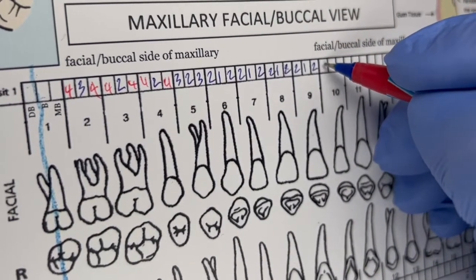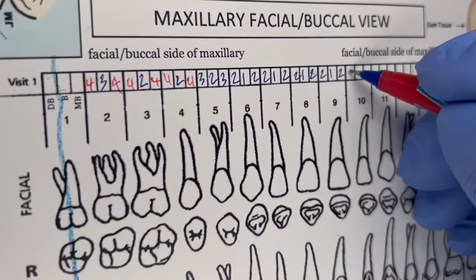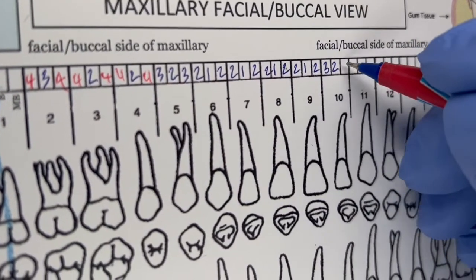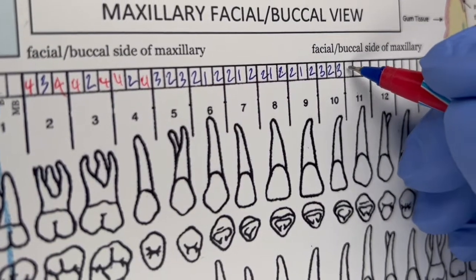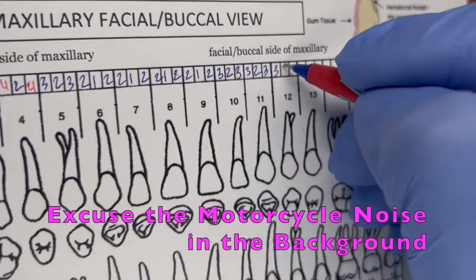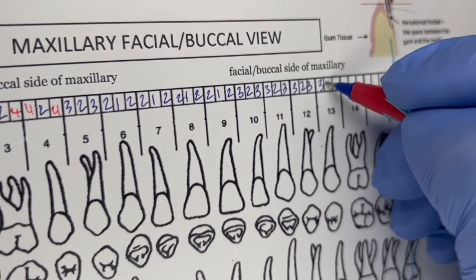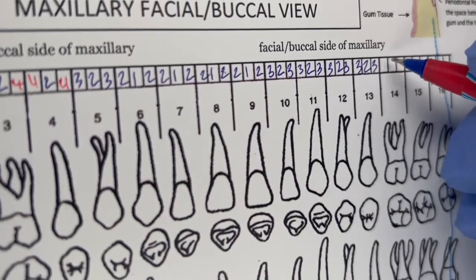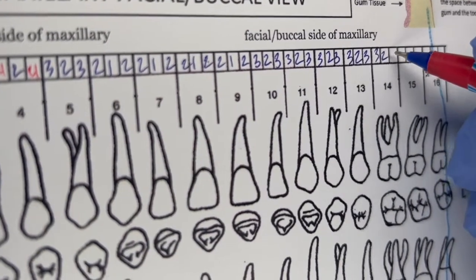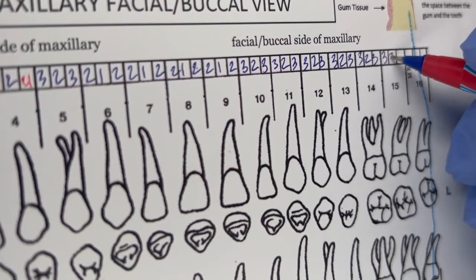We're on number 10 — confirmed. Number 10: 3, 2, 3. Then 3, 2, 3. Continuing through the maxillary to number 15: 3, 2, 3. And number 16 is missing.